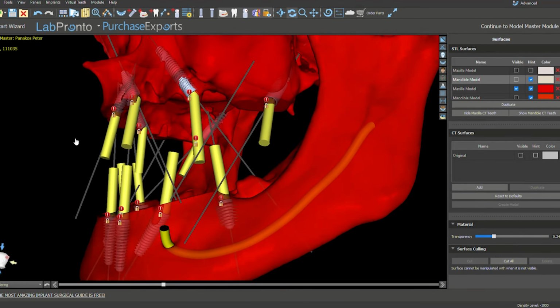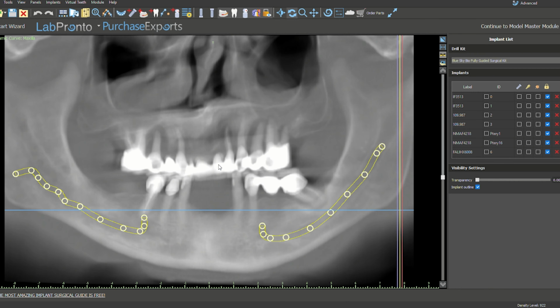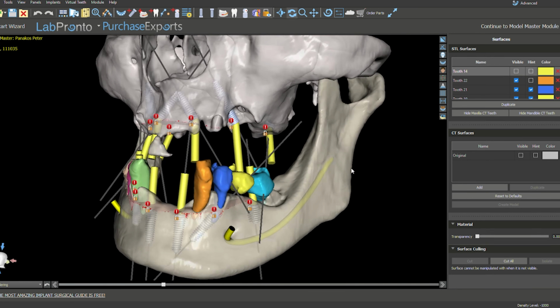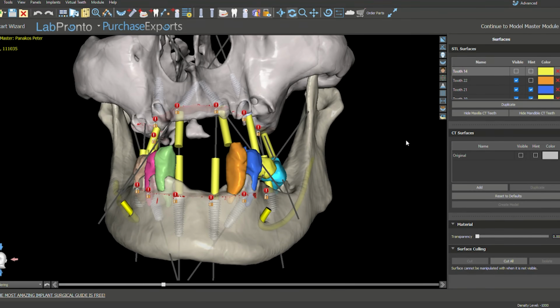This is our CT panel view. You can see pathology here, all these teeth are failing. This bridge is actually temporarily cemented now. It comes in and out of his mouth, and the granulation of the tissue is holding those teeth together.